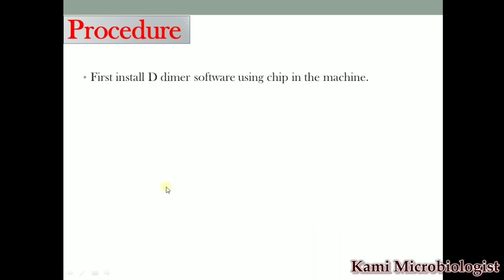First of all, what will you do? As we already talked, first of all you have to install the D-dimer software using the chip in the machine.